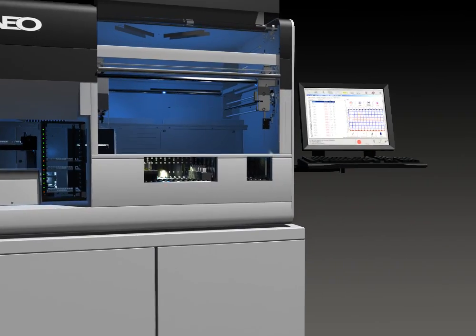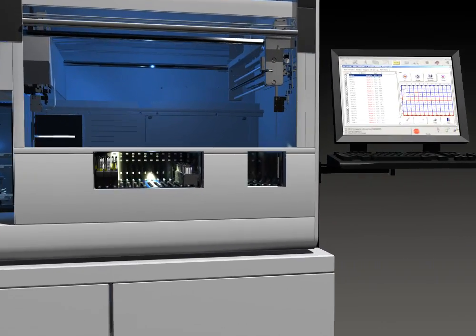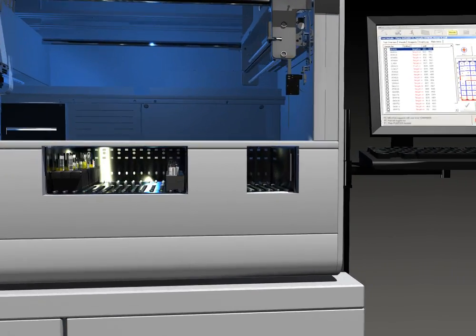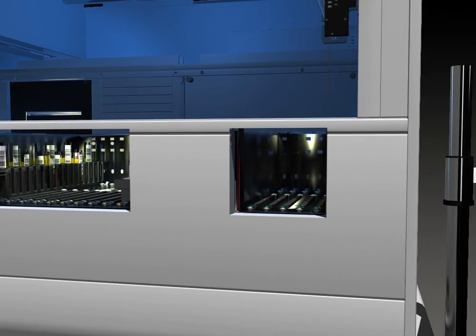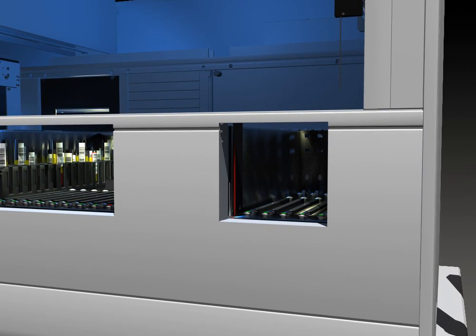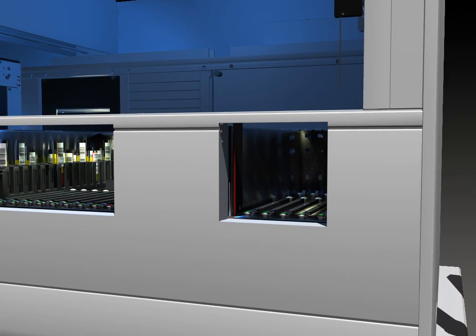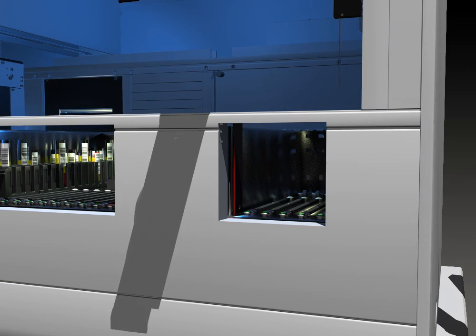In the front of the NEO, you can see the reagent and sample loading bays. Using linear racks which hold up to 16 samples each, NEO has the capacity to load up to 224 samples at one time.